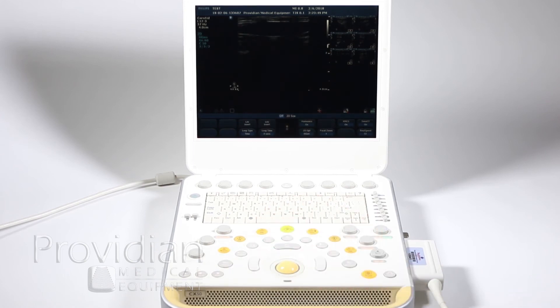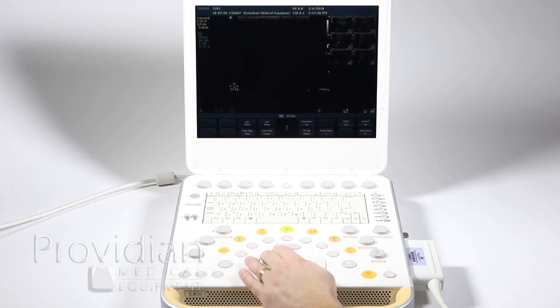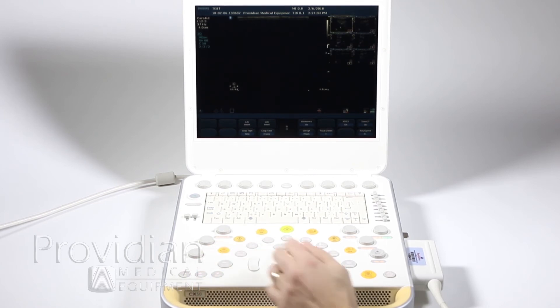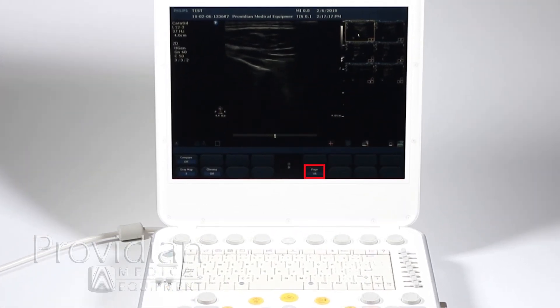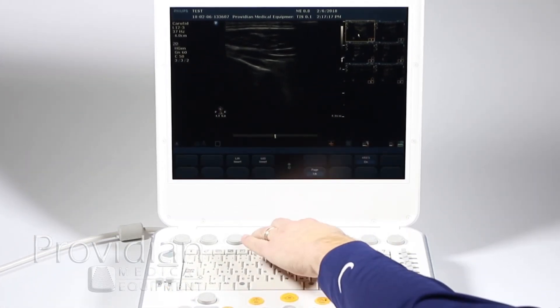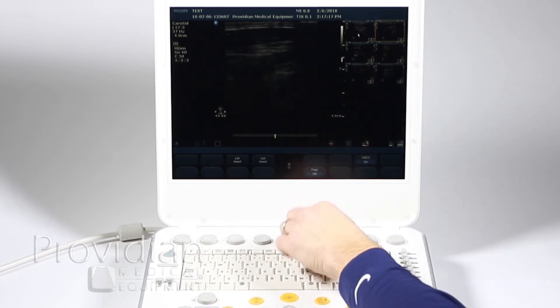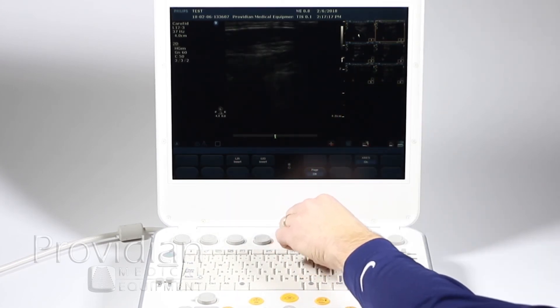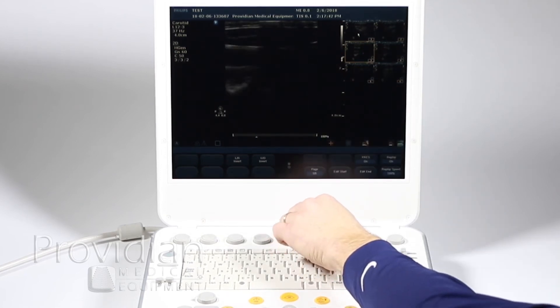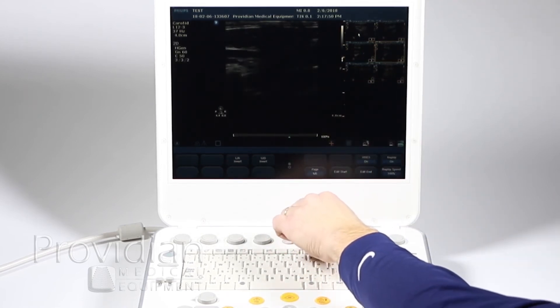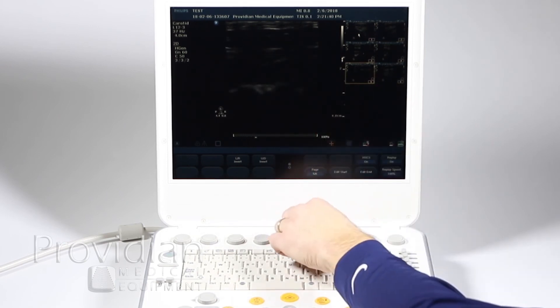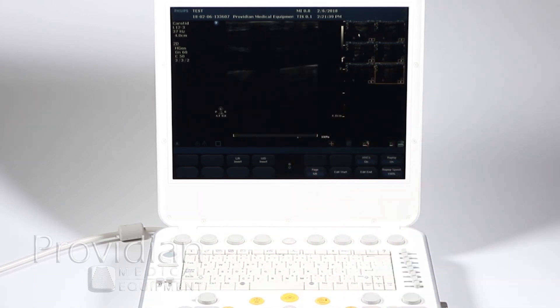To get out of there, I'm just going to hit the 2D key again. Now there is one more way to scroll through those images. I'm going to go back to my pointer and left-double-click on one of them. Now it says page 1 of 6 — this is actually image 1 of 6. Now it's highlighting the second, the third, the fourth, five, and six. That's actually an easier way to scroll through the images rather than dealing with the pointer.